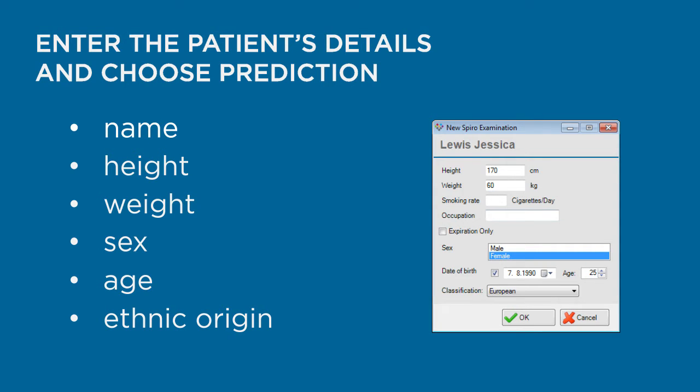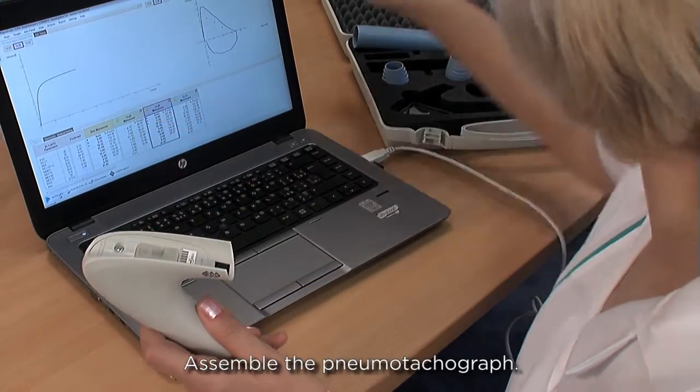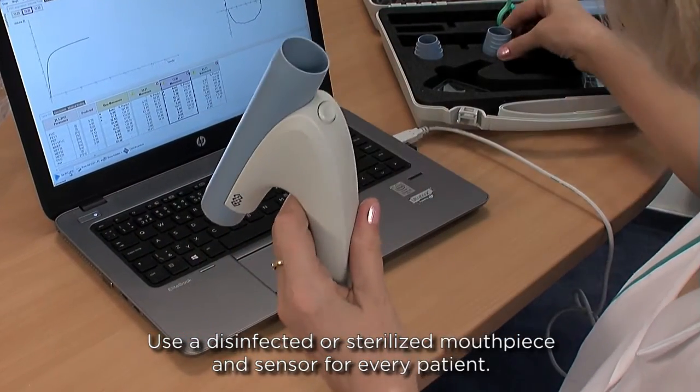Next, select a suitable prediction. Assemble the pneumo-tachograph and use a disinfected or sterilised mouthpiece and sensor for every patient.